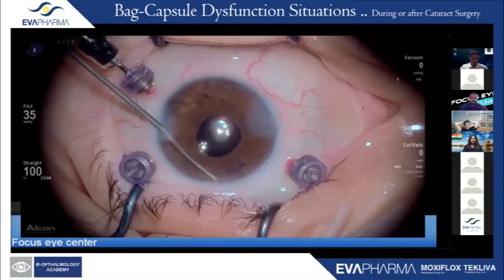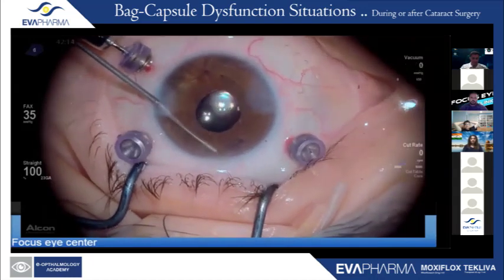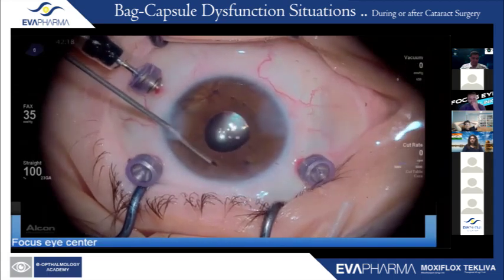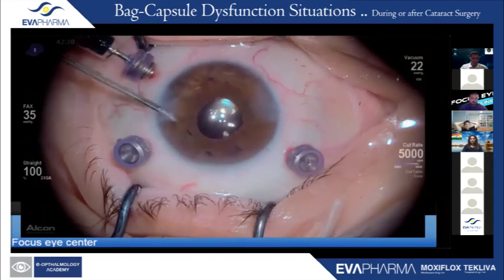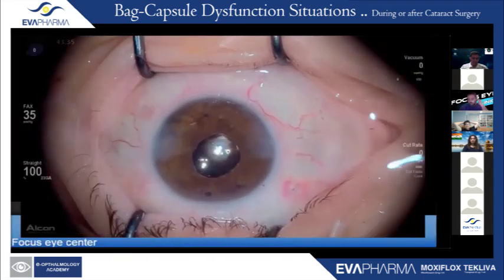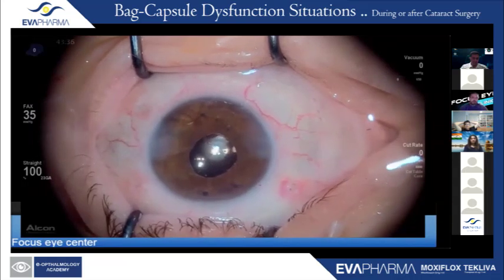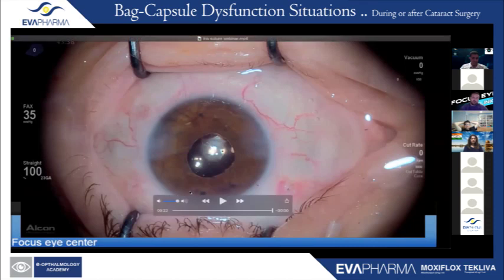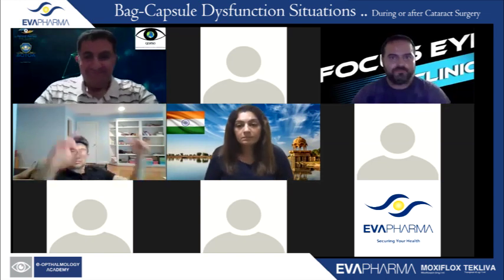Again, peripheral iridotomy. And I believe this is a good technique for elder patients. But actually now I'm doing Carlevale scleral fixation, which is something new, and I believe it's better. And that was my cases.